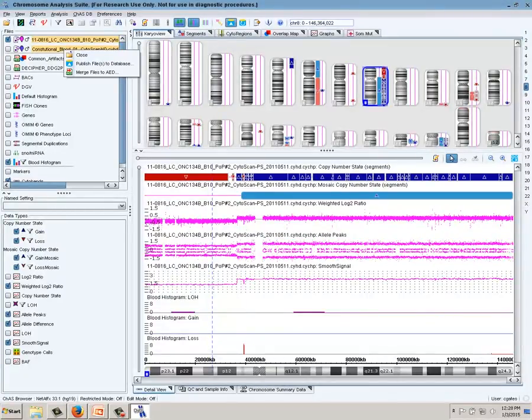All right, so in this module, we learned how to query the ChAS database and to assign annotations to both the sample and the segments, as well as how to change our database coverage and overlap. Please proceed to the module on reporting in order to see how to export the various graphs and tables from the sample that we just analyzed into the new Word format.